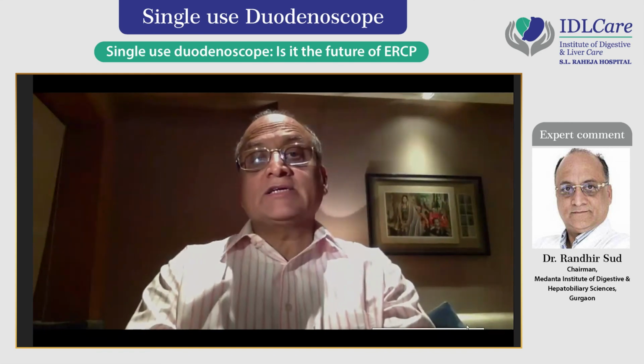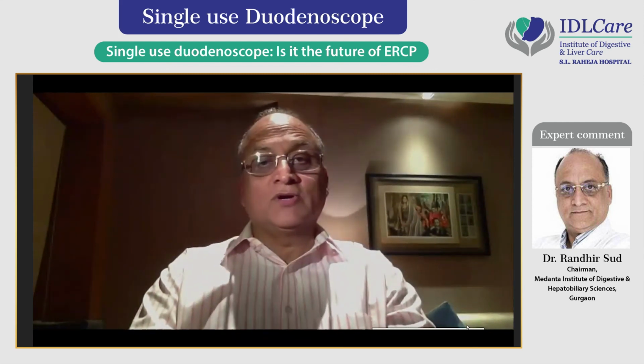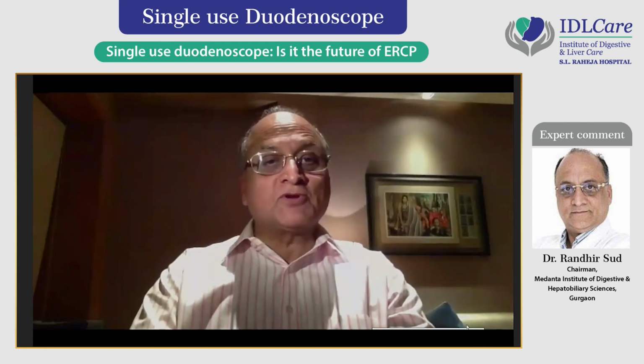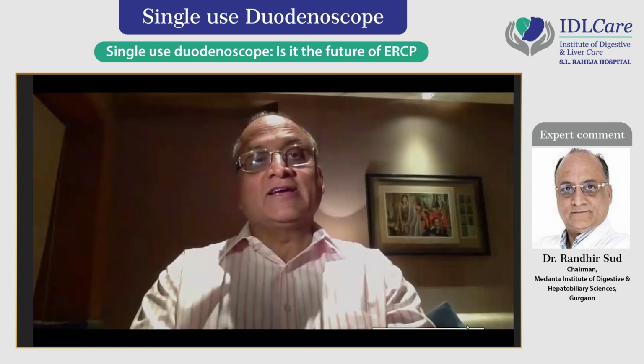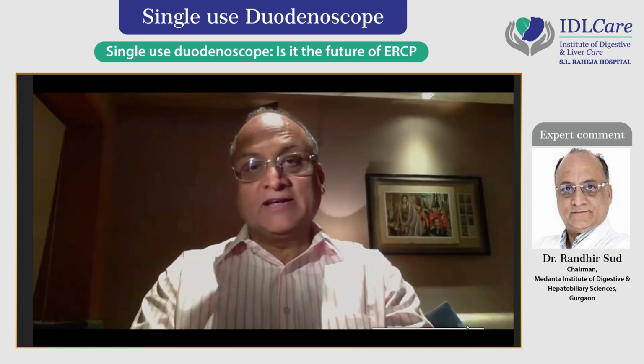If the cholangitis was only happening due to sterilization, then, Mohan, in India every patient would be having cholangitis, because reprocessing of duodenoscopes, the way we used to do it 10 years back, was not the way you would reprocess even your dining wares.